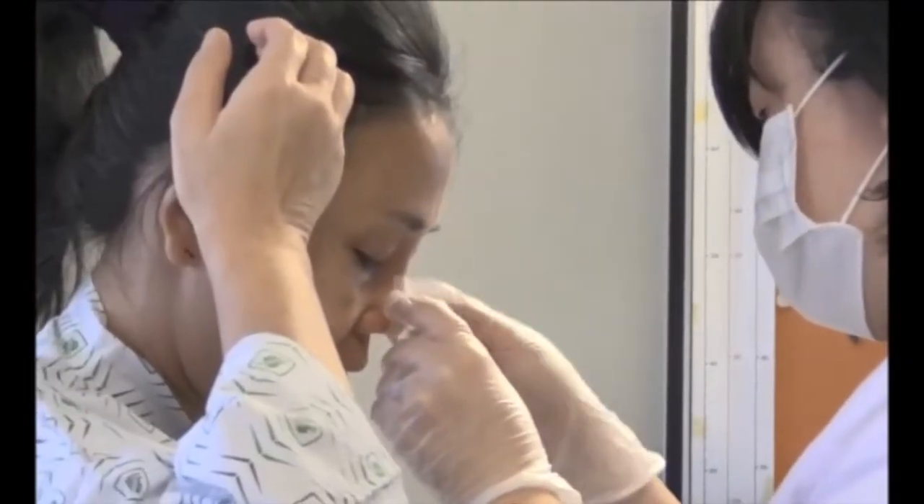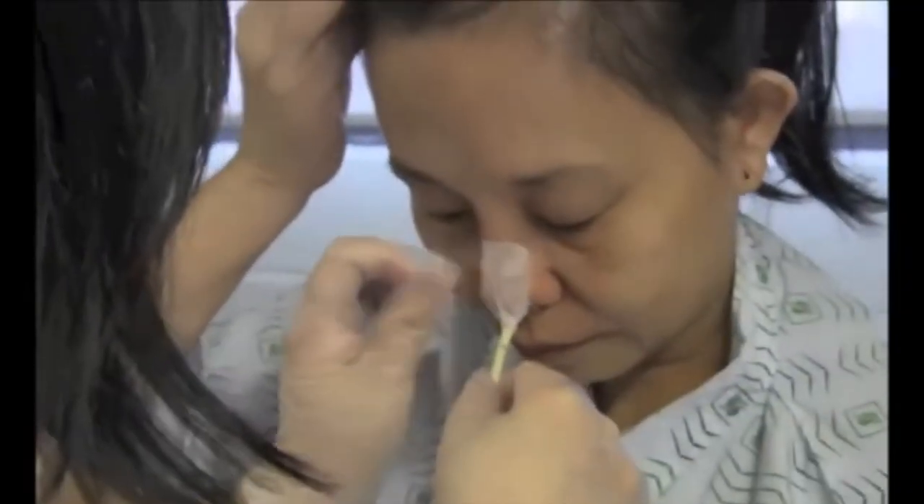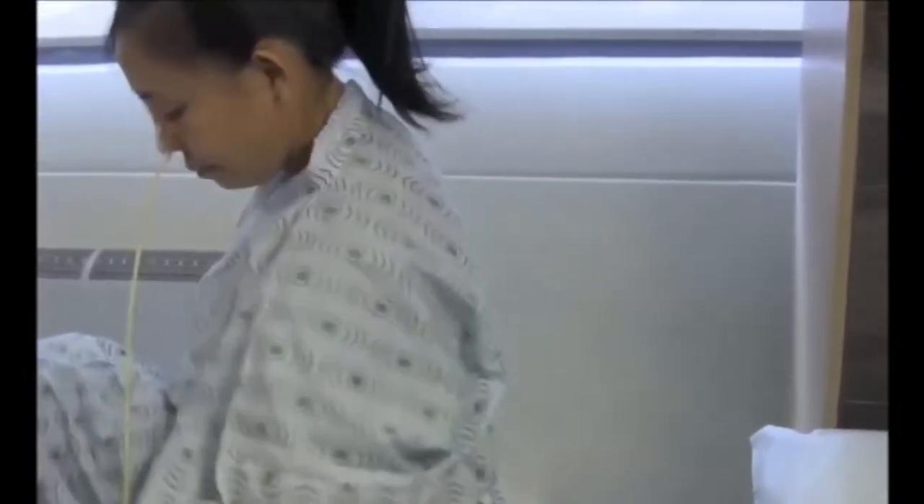Once the position of the catheter is confirmed, it will be secured to your nose via a tape. You will then be asked to lie down and make yourself comfortable.